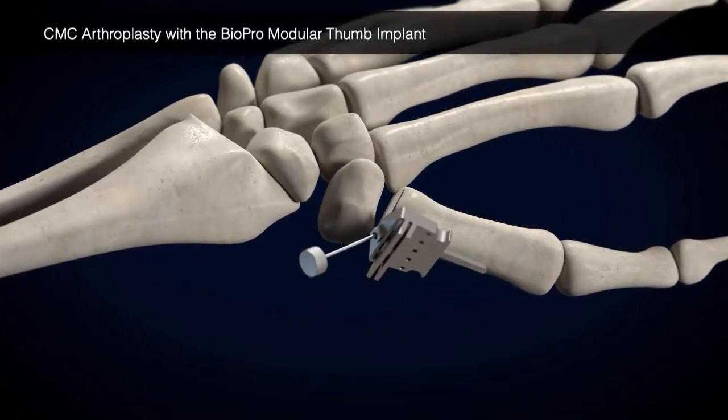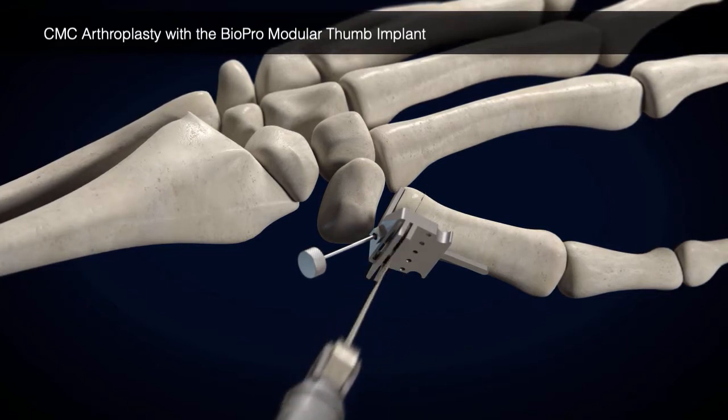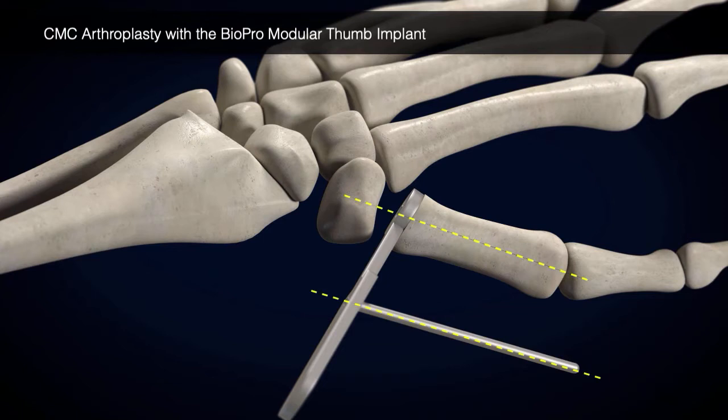Using the resection guide, resect approximately 5 mm of the metacarpal base. Place the alignment guide on the resected base of the metacarpal and ensure the alignment pin is parallel with the metacarpal, ensuring the cut angle is correct.